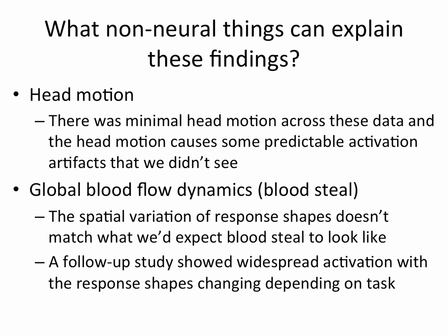I forget how minimal they were on these 3 subjects, but I know so Ben in the front row, we're working on one of the follow-ups. Do you remember the numbers from earlier today? The Euclidean norm of the 6 motion parameters was less than 1 for 95% of the runs. Yes. So essentially, there was less than 1 millimeter degree of motion for 95% of the runs in 2 subjects. So those 2 subjects were phenomenally low movers.